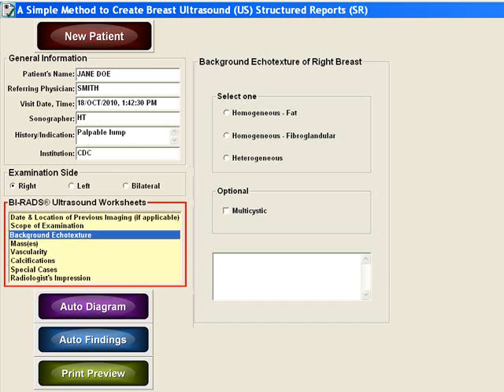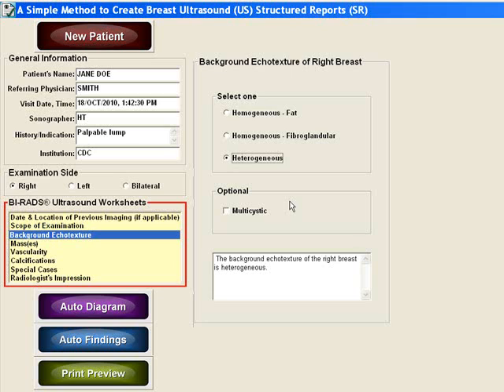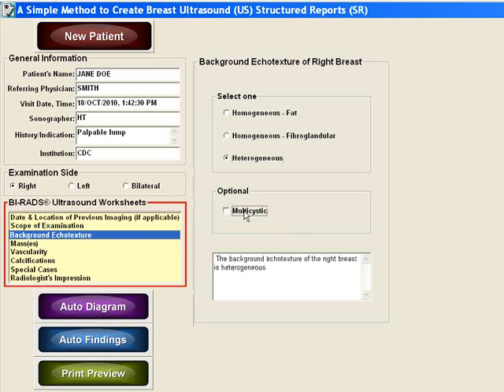Next you will record the background echo texture of the breast. Using the BI-RADS criteria, click on the appropriate descriptor. You also have the option of selecting multi-cystic if the patient has many cysts.